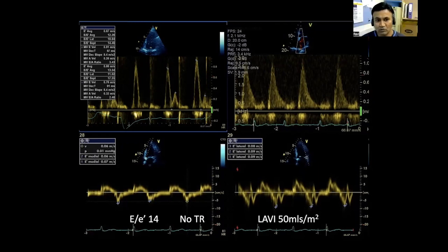So mainly from 2D, the only significant finding was a dilated left atrium. Nice. Yes, and we did have some annular calcification at the mitral valve, maybe some at the aortic valve. But there was no thickening of the left ventricle, and the left ventricular systolic function was normal. Yes, absolutely. You mentioned the intra-atrial septum bowing across to the right as well. Right, yes, that's right. That's a nice safety marker, isn't it? Yes.